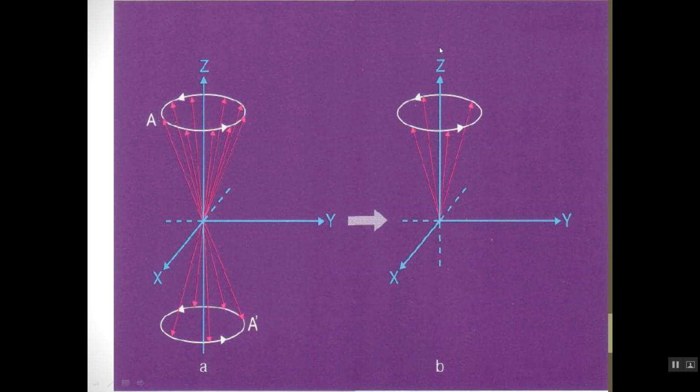Now the protons are in the z direction. If I put a receiver here, a radiofrequency coil, to receive the signal coming out from this magnetization, the protons moving in the z direction and moving in a coil will induce current in this coil. This current is my signal.